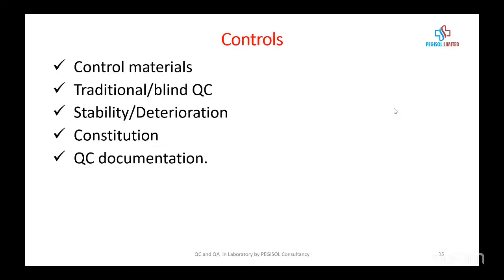So next, you need to also check the control itself, the control materials. The traditional control, blind QC, stability: what is the stability of the control?